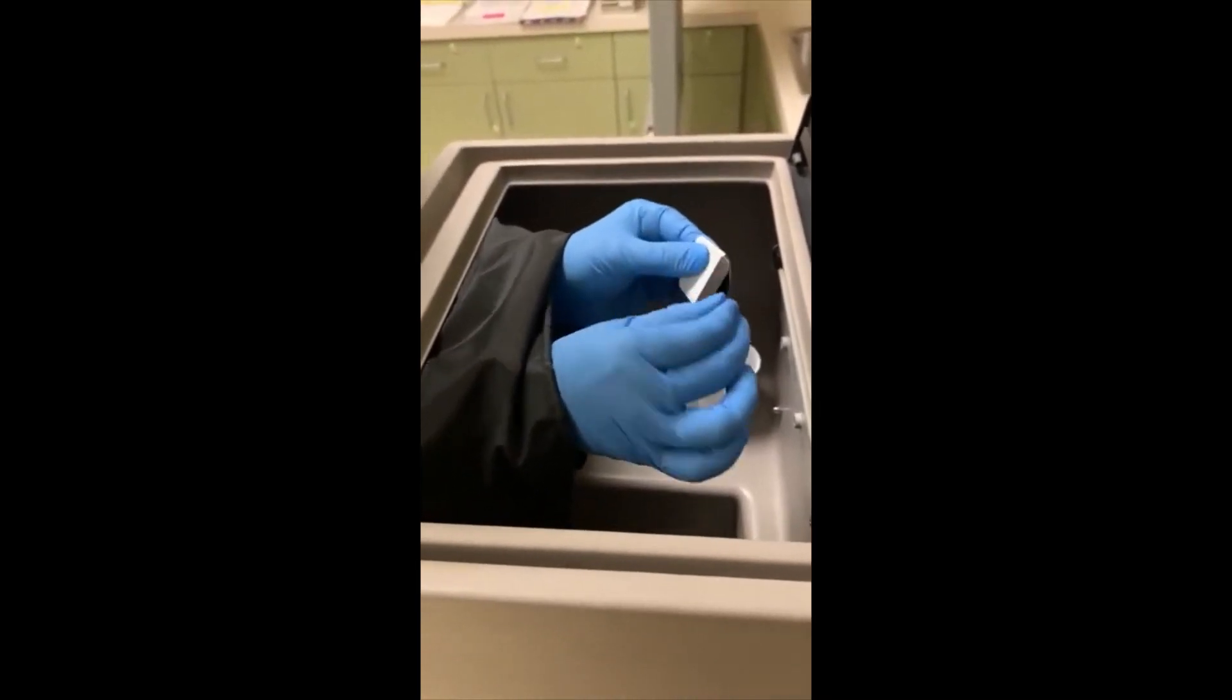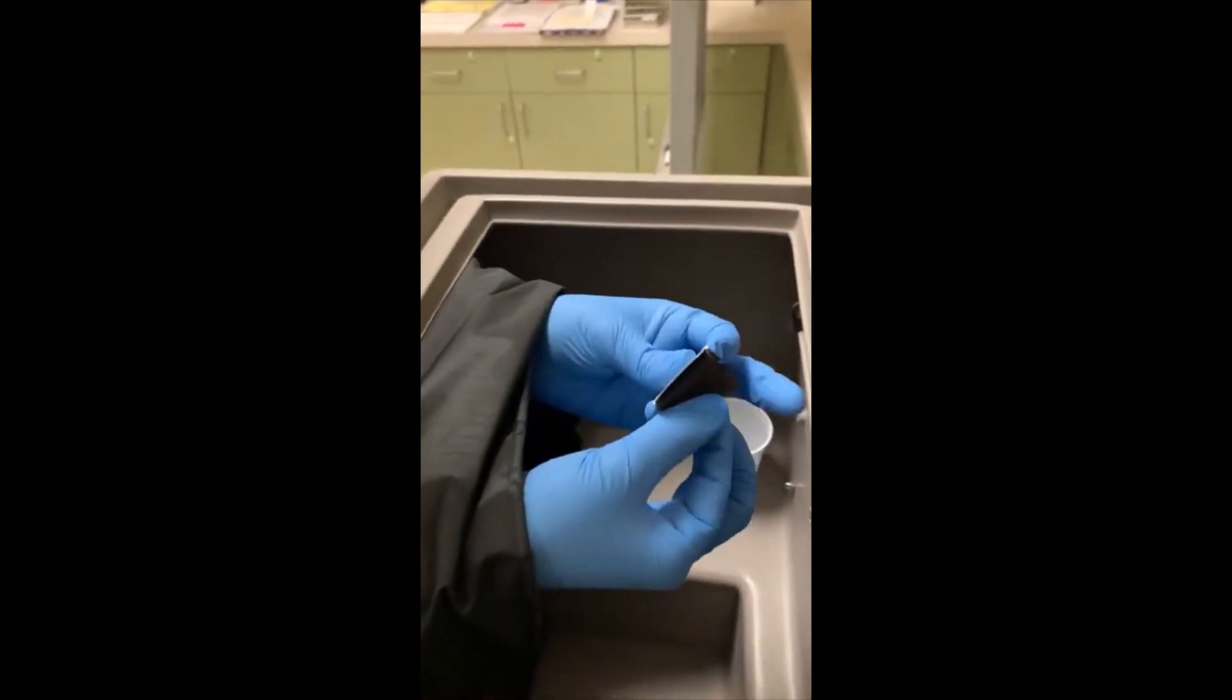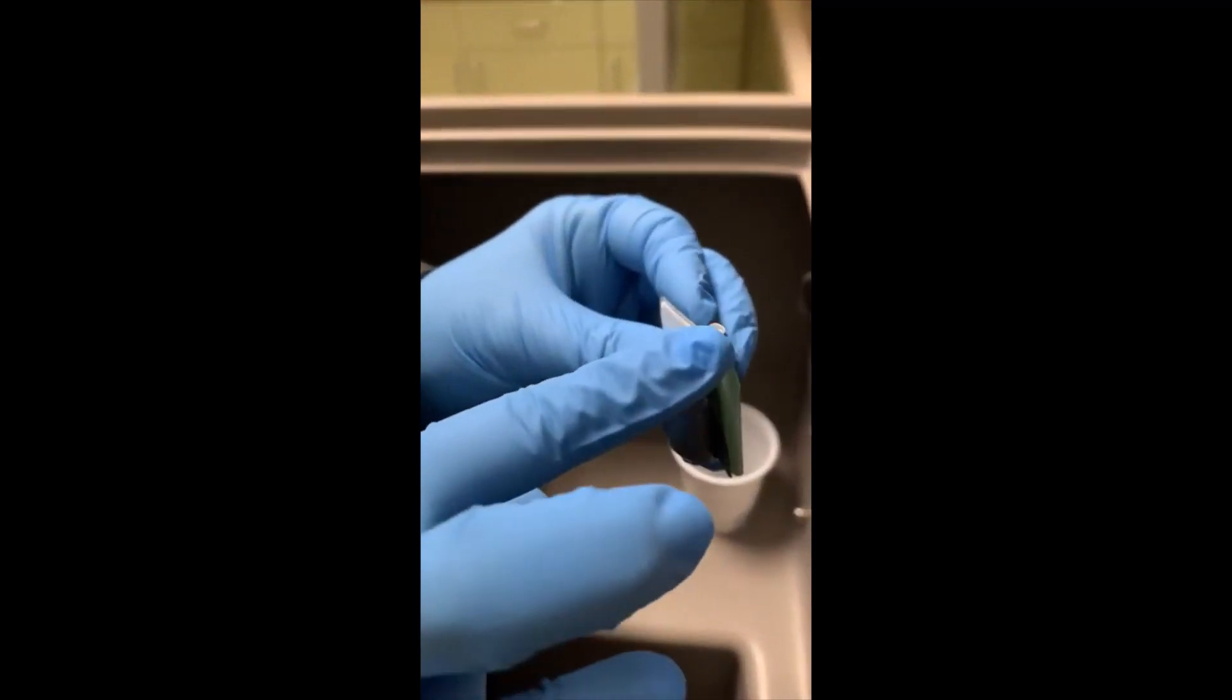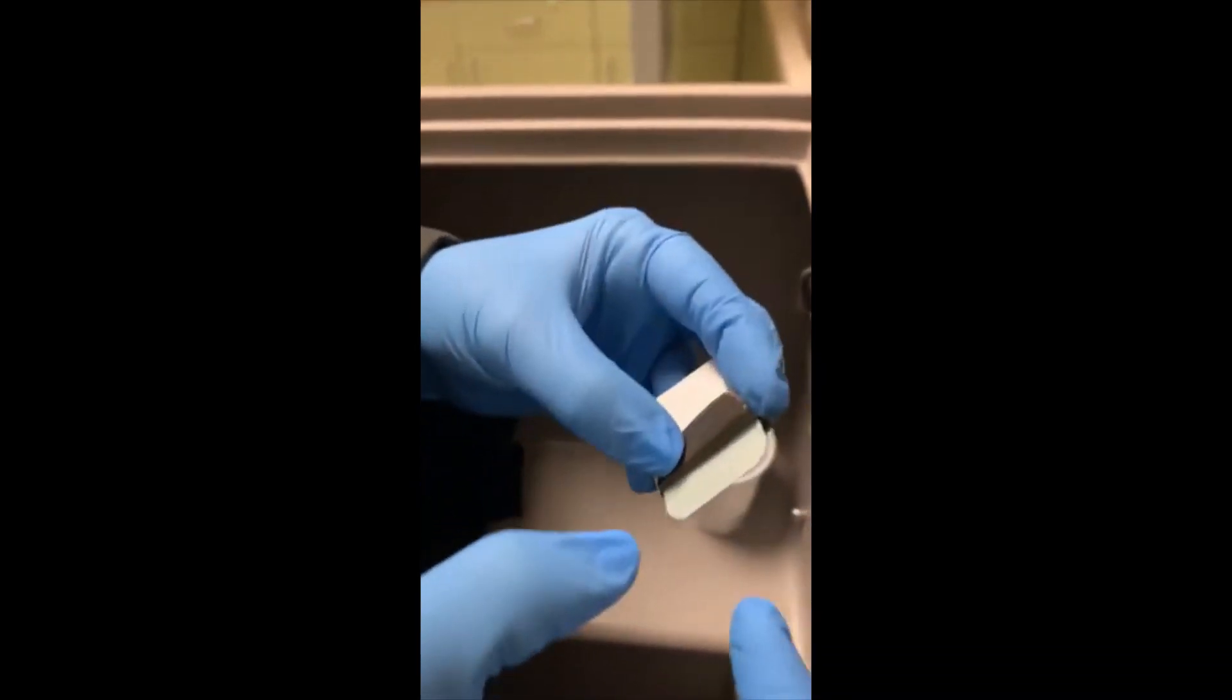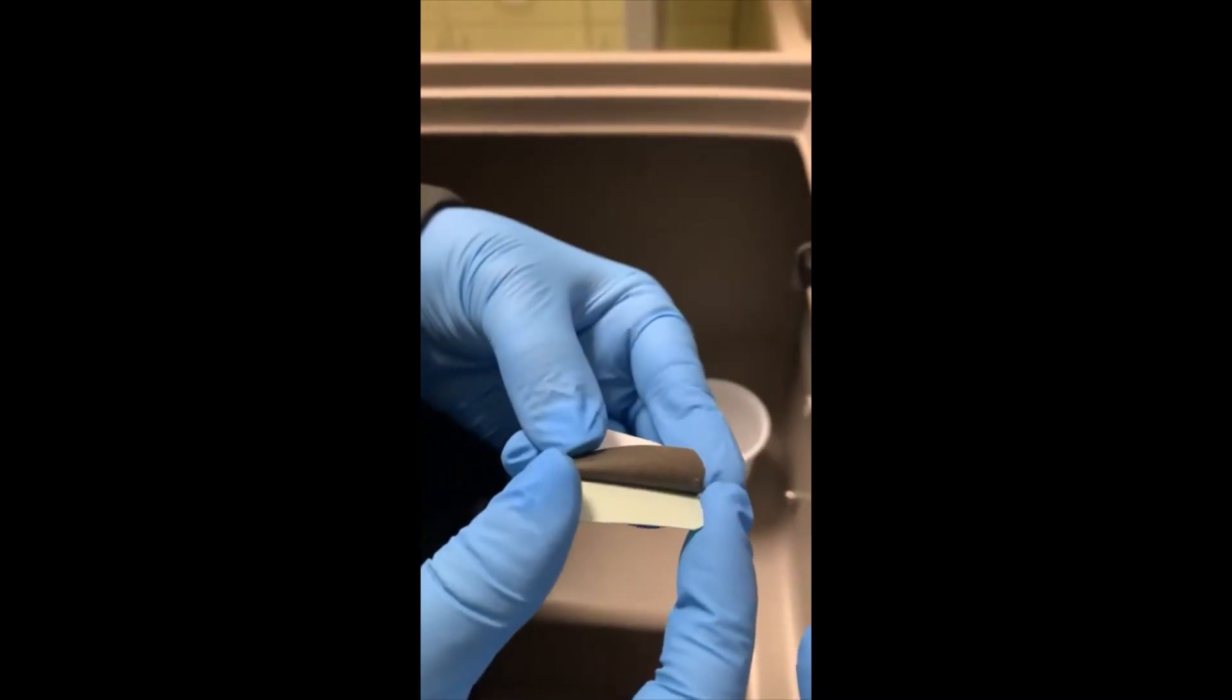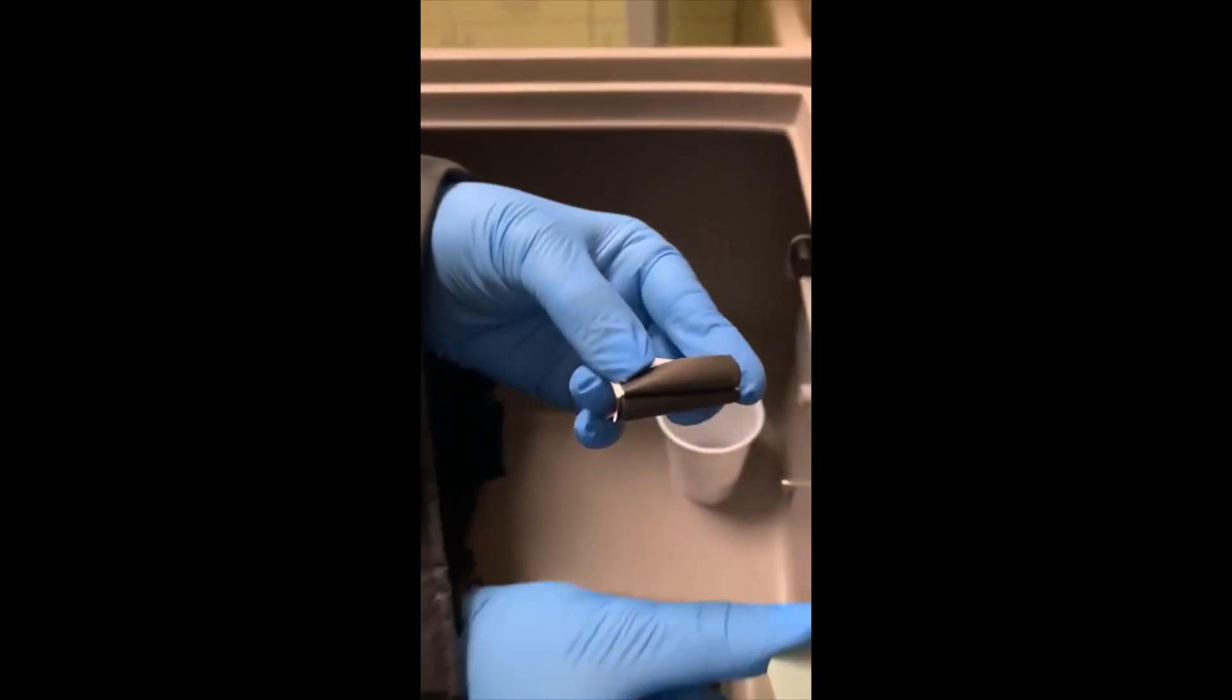This green part right here is the film, so you're going to only touch it from the sides so that you don't put your fingerprints on it and you don't grab it with your nails. You'll only pull it out from the sides, just like this. Then you'll set this little piece of film down on this ledge right here.